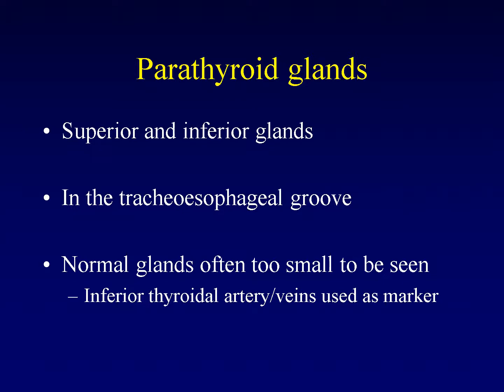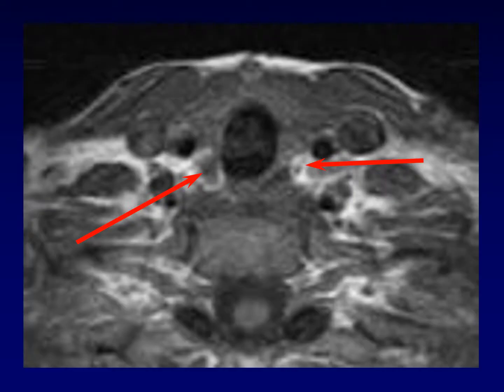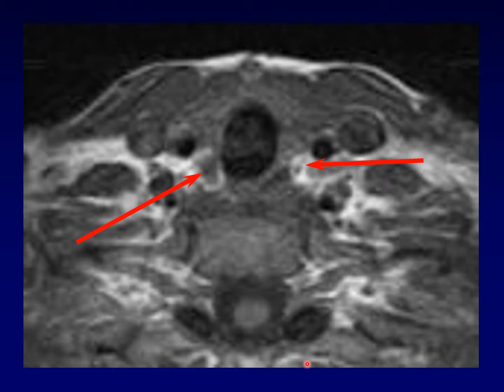Sometimes the glands are large enough to be seen, even when they aren't affected by adenomas. Here's what we're looking for. On the left, we're seeing the vascular structures in the tracheoesophageal groove — the artery and vein. On the other side, we can make out the parathyroid gland itself, even though it's not truly an adenoma in this patient. The key location is in the tracheoesophageal groove, right behind the thyroid gland.